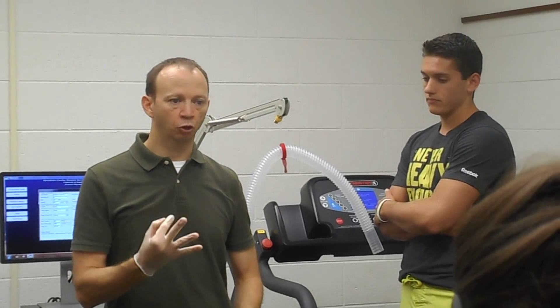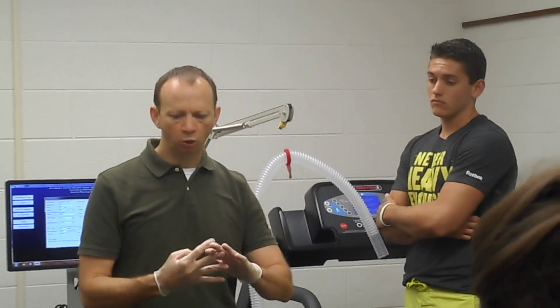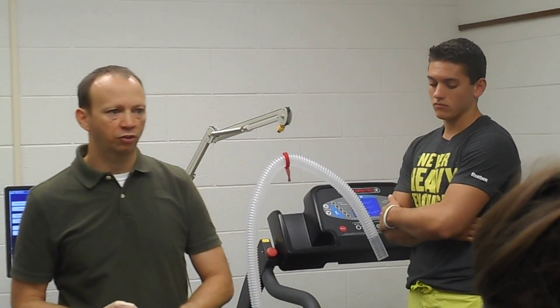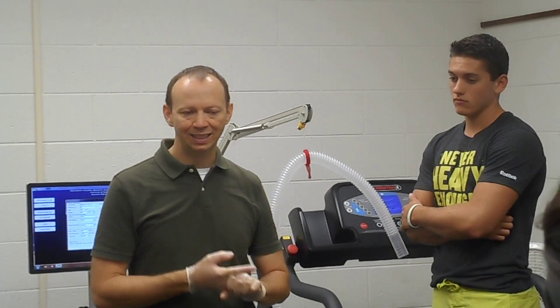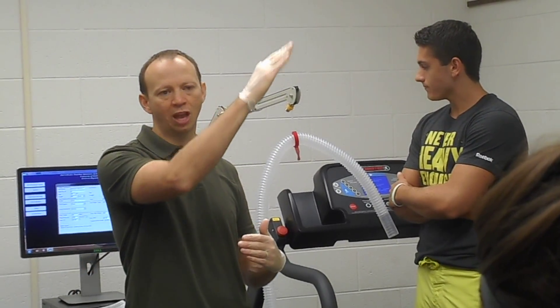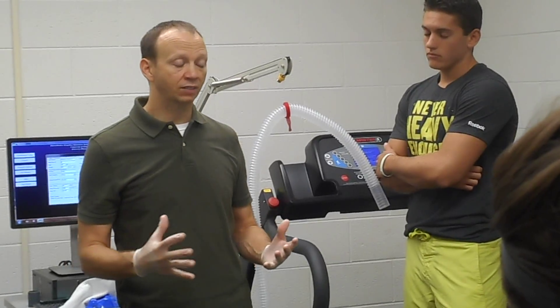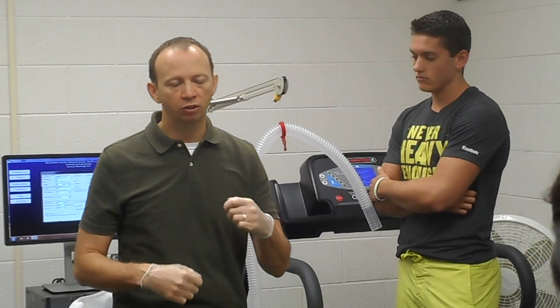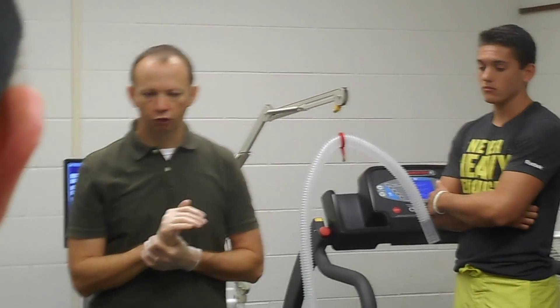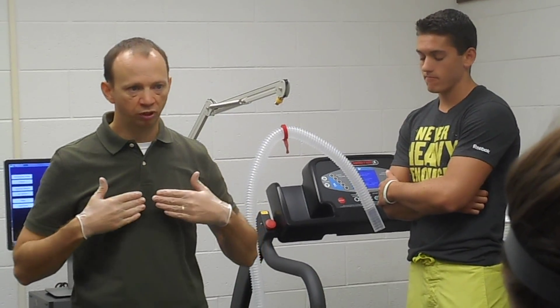I'll describe the numbers we'd expect for each of those variables. The classic indicator of a true VO2 max is at the end — did they give you a nice plateau of VO2? As the test starts out easy and gets harder, you'll see VO2 climbing rapidly with each increase in workload. But if a true VO2 max has occurred, at the end we may be increasing workload but VO2 is very sluggish or doesn't go up at all. I'll also mention ventilation — VE, or minute ventilation, is just how much air you're moving in and out.